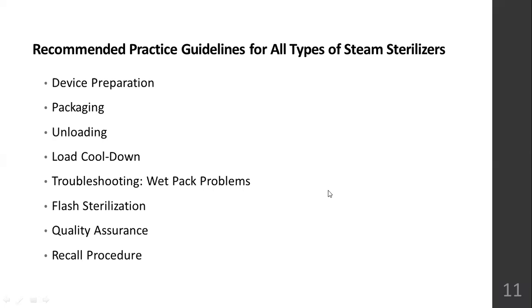And packaging: there are specific cloth and fiber materials used for packaging the articles. Everything that goes into the autoclave should be packaged. If it is not packaged, it is not considered sterile.